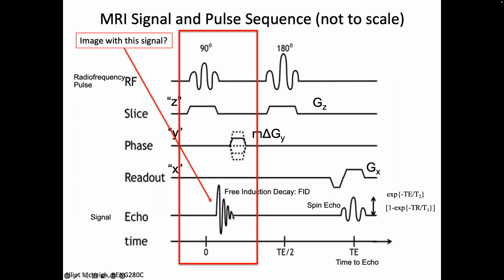When we first got, I think in 1990 maybe, the first echoplanar imaging system made by GE, it had two gradients, phase and readout, with massive amplifiers that were tuned to a specific frequency, so they could really rock. They could go super fast, right?